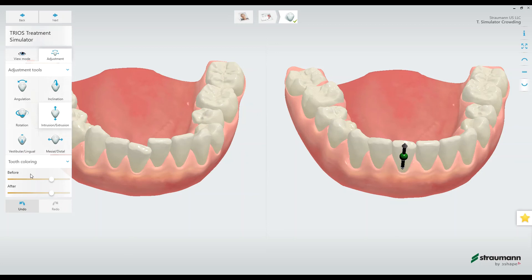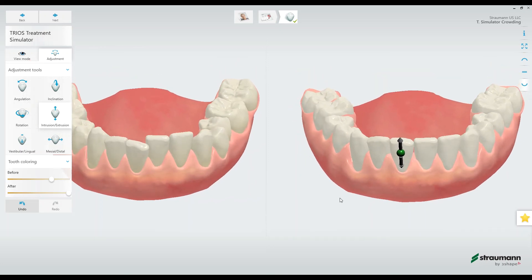Down here we also have the tooth coloring before and after. If whitening is part of the treatment plan, we can show what that would look like here as well.